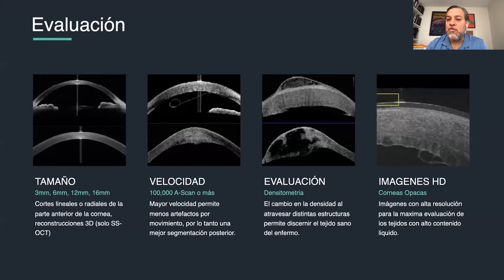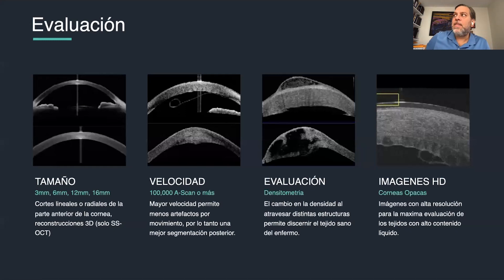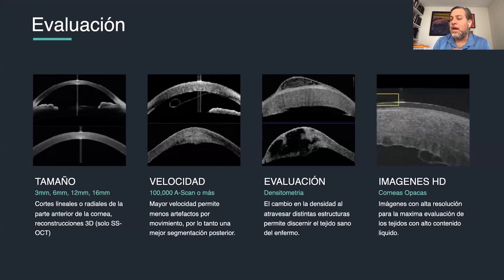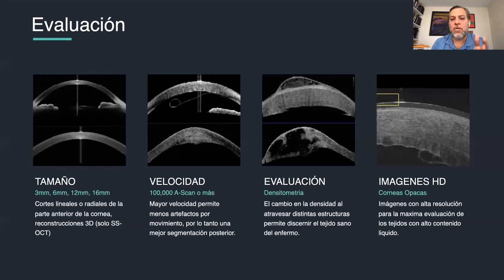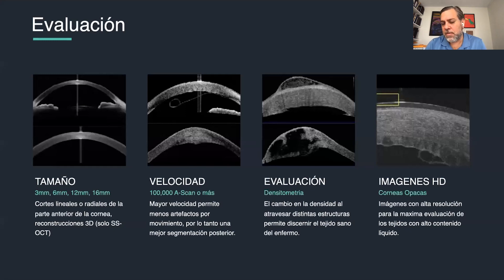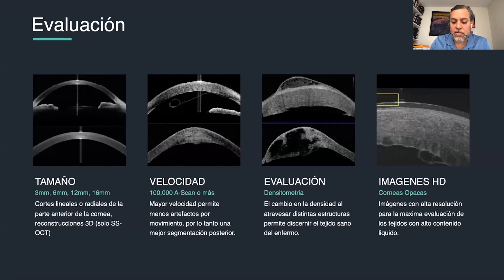Densitometric evaluation is a valuable feature — density changes in the anterior segment can indicate the type of pathology present, which is why OCT is sometimes called an in vivo or live biopsy. For glaucoma surgery evaluation, such as trabeculectomy, you can assess whether the bleb is well formed, whether it is cystic and no longer filtering, and you can image through opaque corneas due to the longer wavelength.